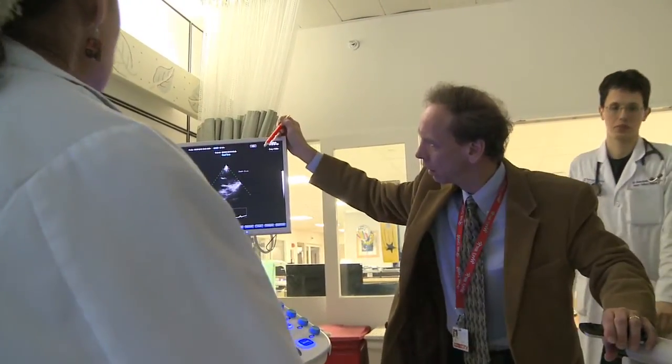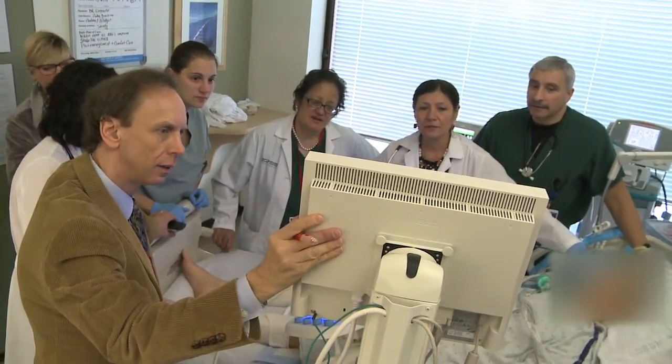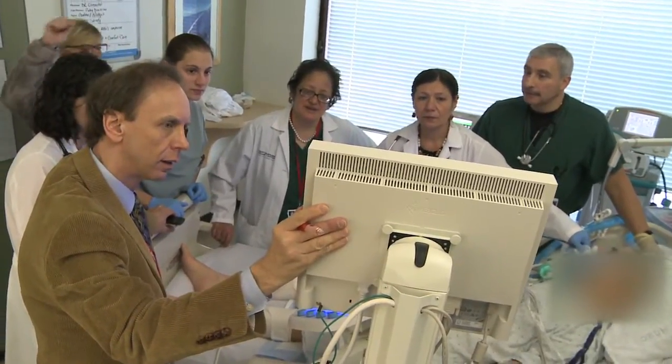With the introduction of the Imacor probe, the world has changed. For the first time, we have the opportunity to actually see left ventricular dysfunction, right ventricular dysfunction, and pericardial space in real time. Quite often it turns out that these patients have right ventricular dysfunction which requires an adjustment in their inotropes. But sometimes the reason that urine output has fallen is because they've developed tamponade. This device allows us to distinguish between right ventricular dysfunction and tamponade, or left ventricular dysfunction.